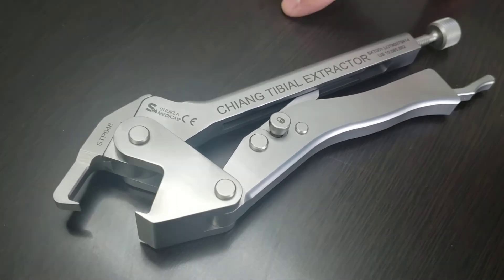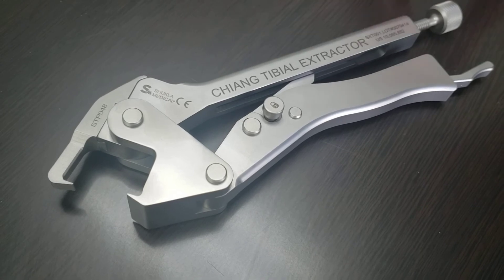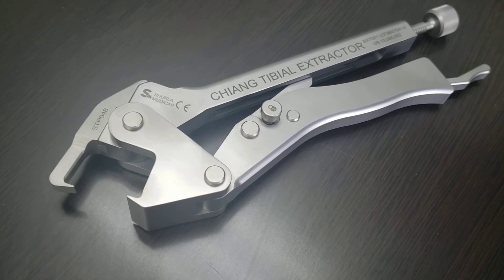Because of this, for the time being, if the jaw needs to be replaced, you'll have to send the extractor back to Shukla Medical and get the jaw replaced with a new one that mates properly with the particular extractor.